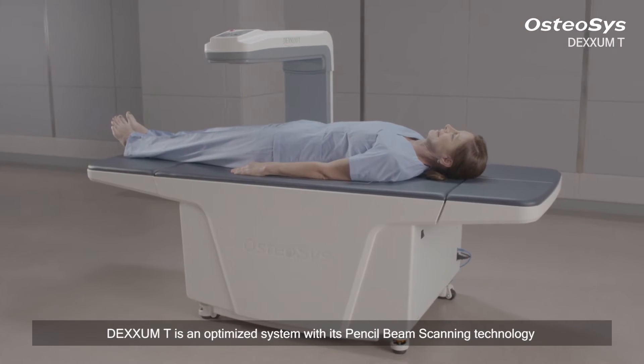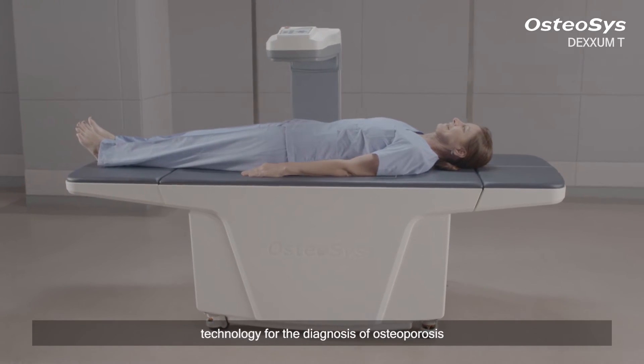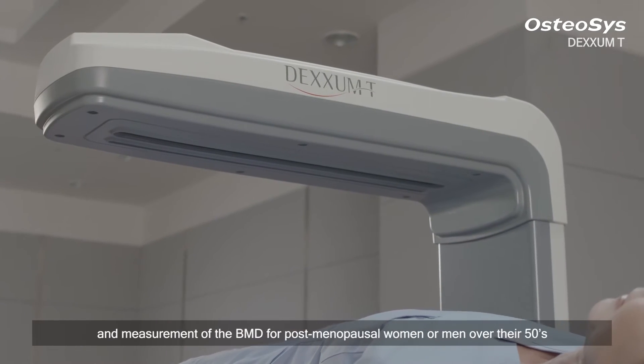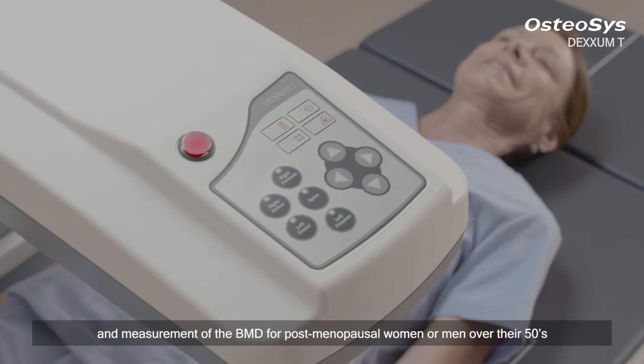DEXM-T is an optimized system with its pencil beam scanning technology for the diagnosis of osteoporosis and measurement of BMD for post-menopausal women or men over their 50s.